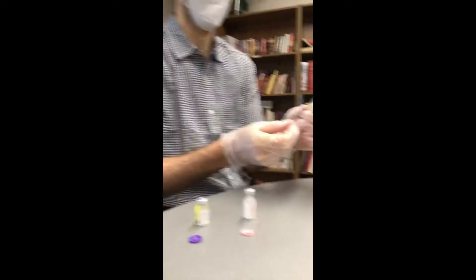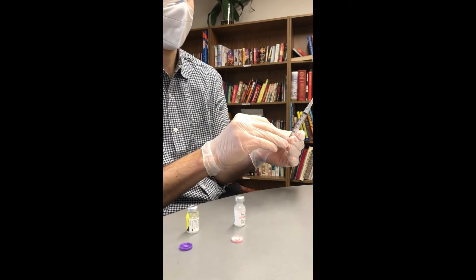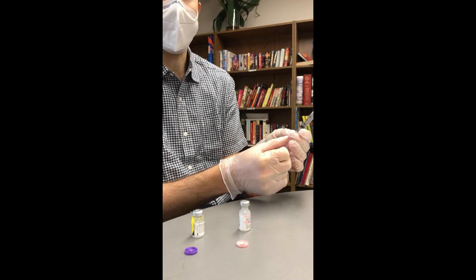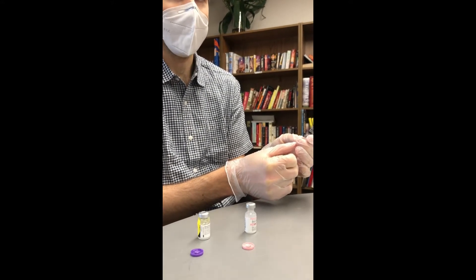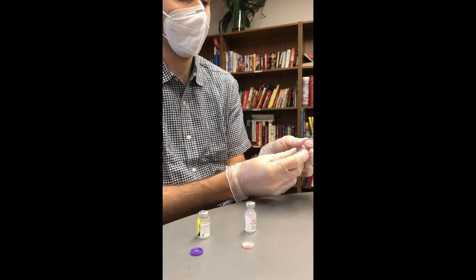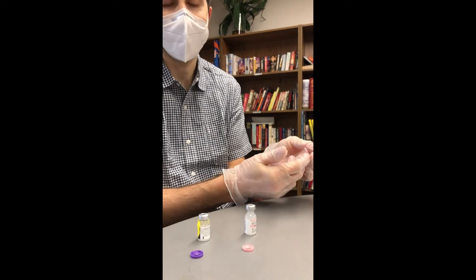So, taking any needle that's at least — basically a 3ml. You want to pull that back. I know the volume is supposed to be 1.8, but I've noticed that if you do 1.8, you get pushback when you pull it out. So I actually get it down to about 1.6 or so, just to give it a little less air.